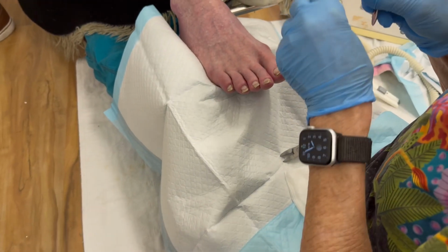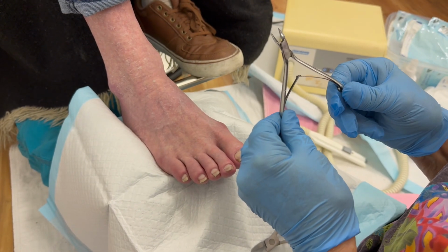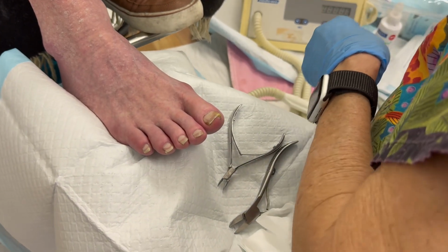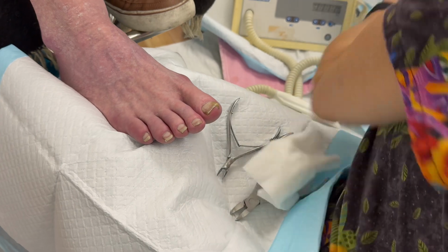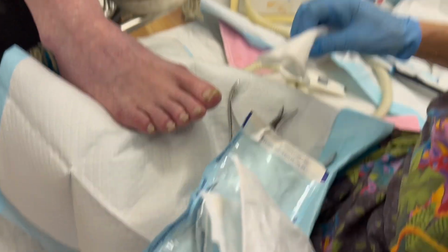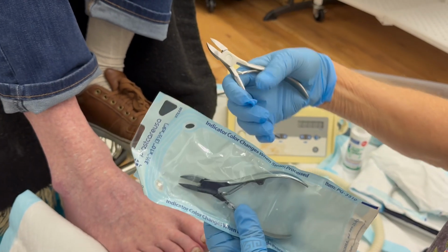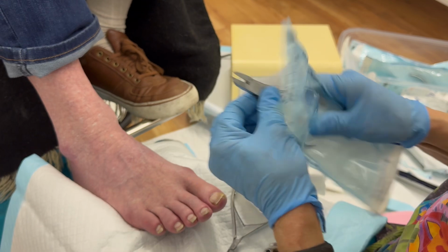But what we're going to be doing is, these are all sterile, just came out of the autoclave this morning. I'm going to be using this 4-inch fine nipper to go in there. And I'm also going to use a couple favorite little ones. This one is smaller. I'm going to put this one away. This is too large of a handle for me. It's okay, but it's not my favorite. This one is smaller and fits me.